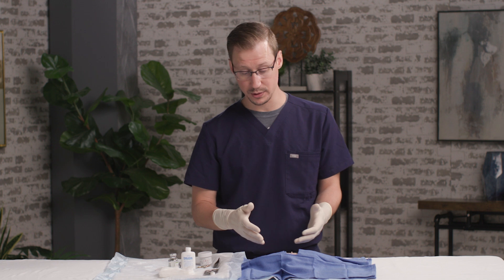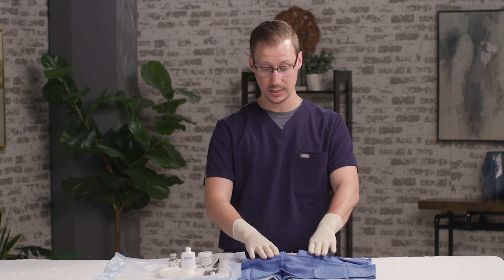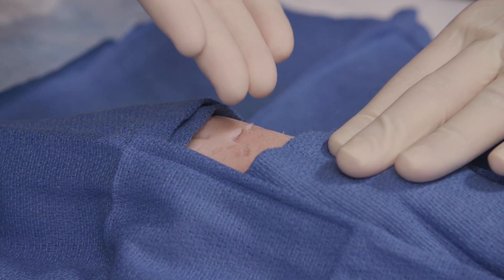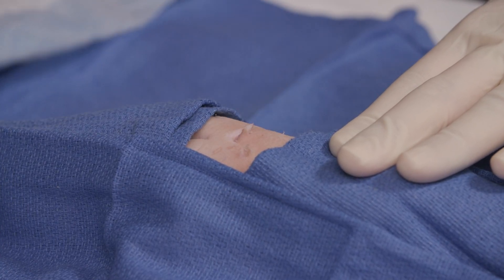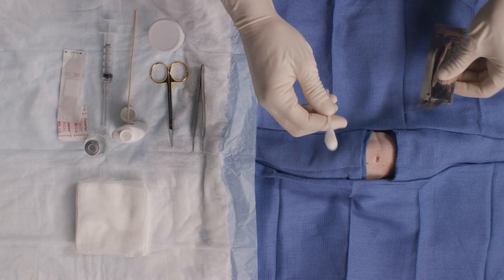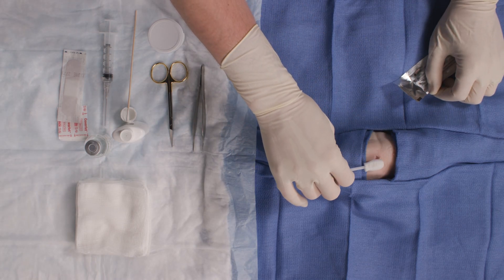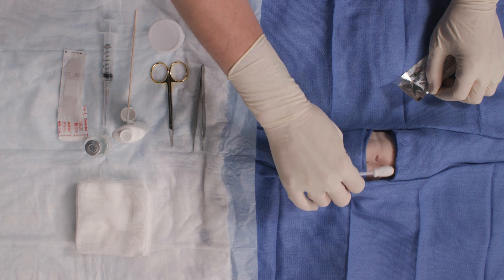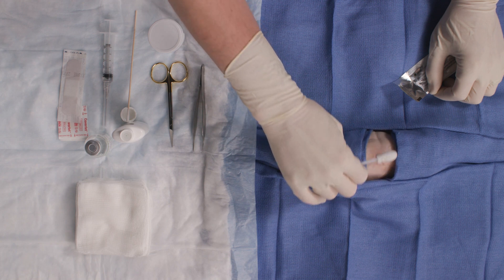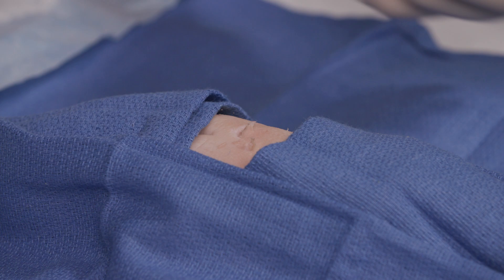The approach to this: you want to get informed consent, set up your tray, then drape the patient in the area and clean really well. We have two skin tags here on our model — one's a little bit larger than the other, but we're going to take care of both today. First, I'm going to clean with some chlorhexidine. Chlorhexidine is activated by scrubbing, so I just want to scrub over the skin tags for about 30 seconds, which activates the chlorhexidine. Clean really well, then set that aside.